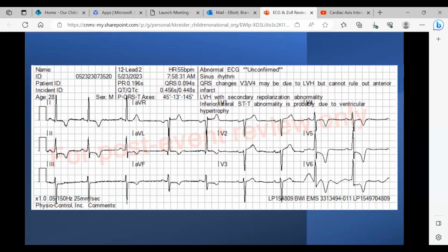Next thing I'll go to is my T wave. Some of the T waves look a little funky, so we can come back to that. Next thing I personally look at is the axis deviation. So aVF is down, lead 1 is up, and lead 2 is up. So I have some sort of left axis deviation. The next thing we're going to look at is V1 and V6, especially with the left axis deviation. That usually tells me it's going to be some sort of block.